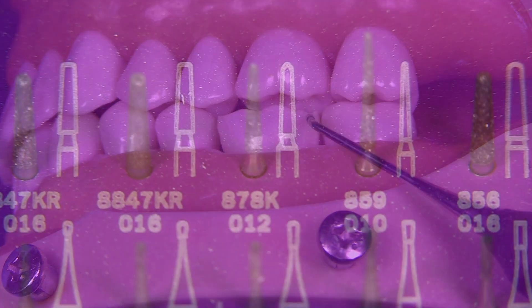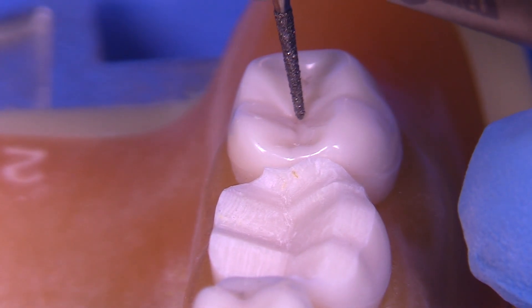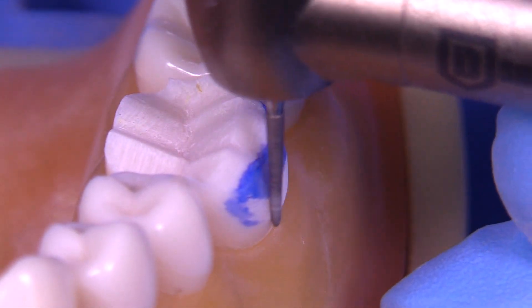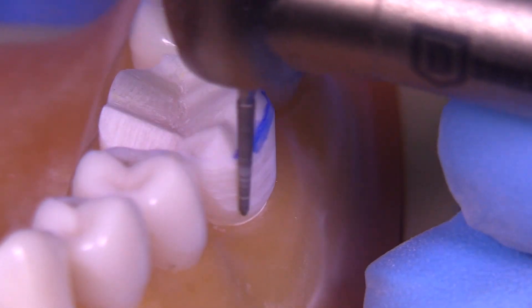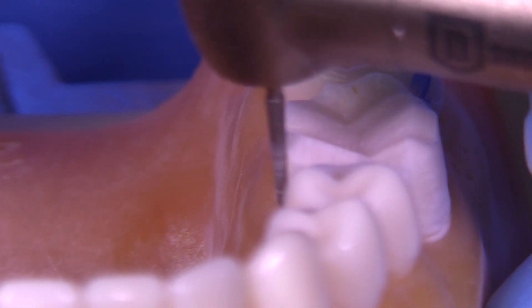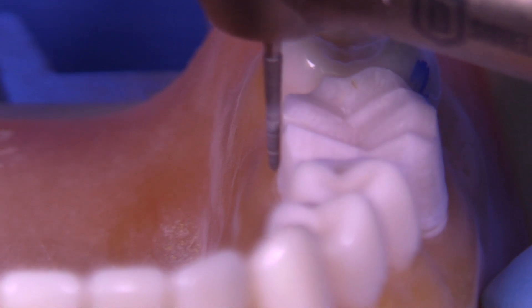Let's move on to the axial. For that I'm going to use the 878K-012. This is a tapered burr — the widest portion is 1.2 millimeters but the tip is only about 0.6 millimeters. We want to line the burr up along the line of draw of the preparation, tipping slightly towards the lingual to be perpendicular to the curve of Wilson. This tooth has a really bulbous facial surface, so we're going to have to reduce a lot of tooth structure to get the burr to engage that last gingival area for the finish line — don't be surprised if this requires more reduction than expected. We then use the burr following the same line of draw to prepare the lingual surface, which is easier because it tends to be on one plane. The facial is more complicated because we need to establish a secondary plane there.